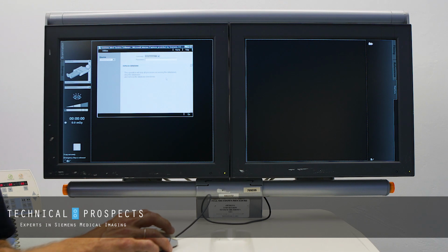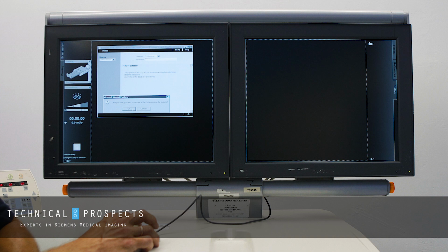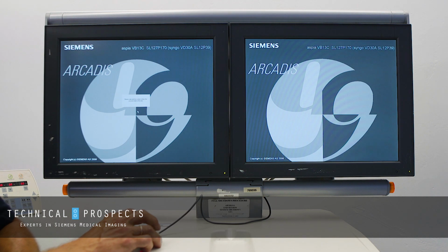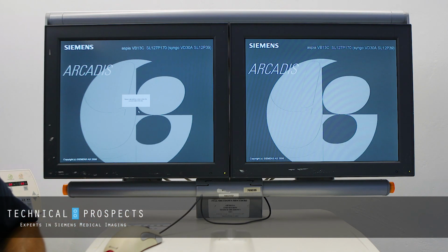When you do so, all the patient information will be wiped off, so you have to warn your user that any previously obtained images will be gone, but your computer will be refreshed and working much better after you do so. So we click Go, acknowledge database deletion, and wait until the system reboots back to the normal operating mode.